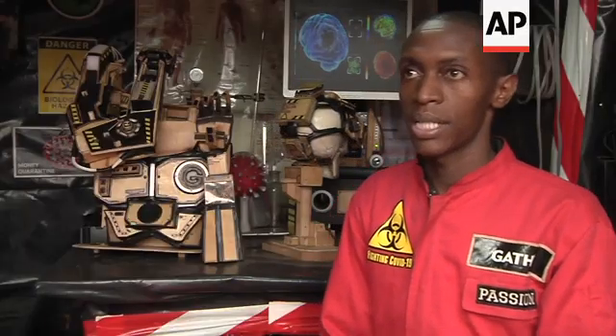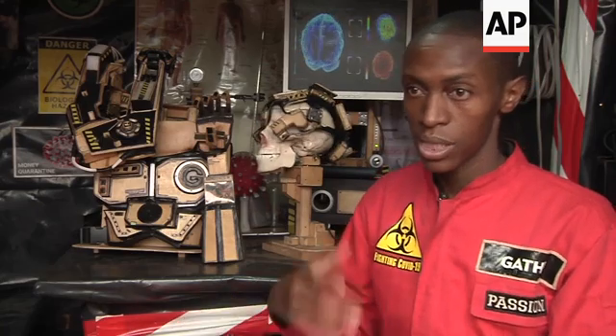This is a biorobotic hand prosthetic that uses brain signals to locomote its hand — to move the hand according to your desires.